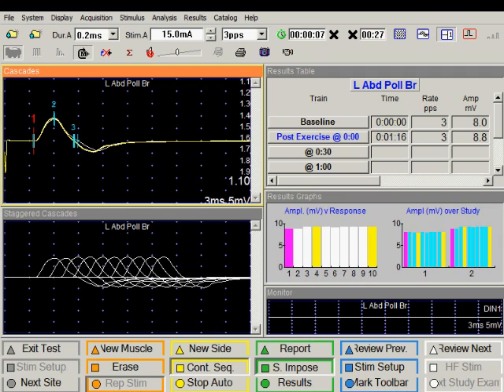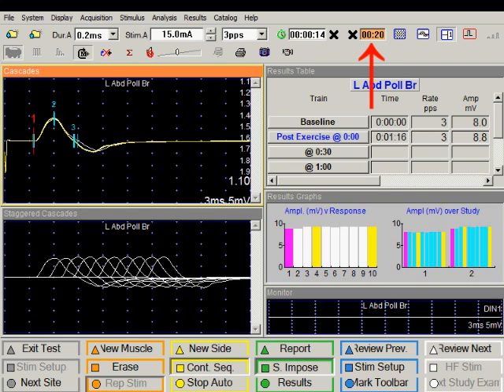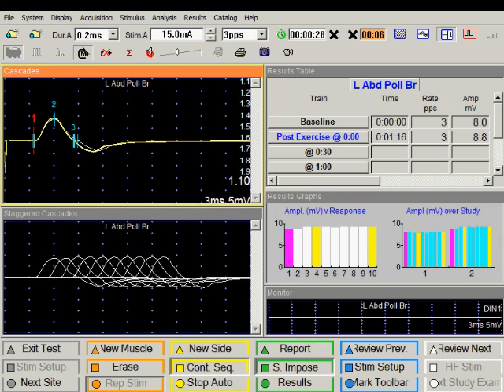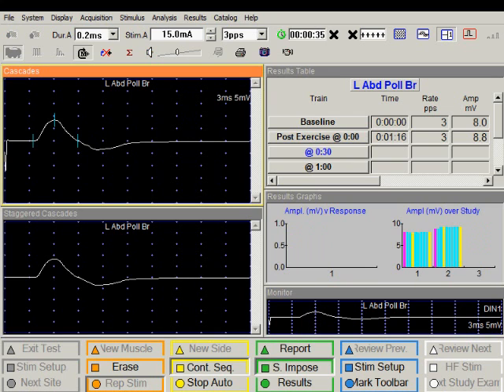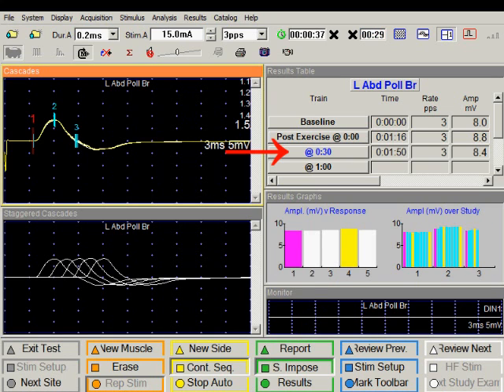You will notice two clocks. One is counting up, indicating the time since exercise. The second clock is counting down, telling us the time to the next stimulation. At five seconds we will get a warning. Traces are saved, and we have another train of stimuli.